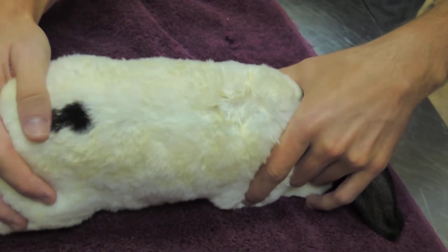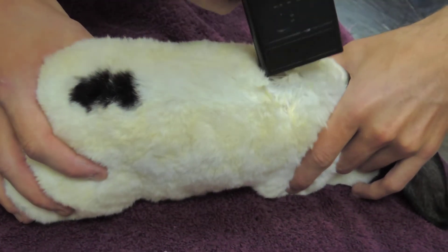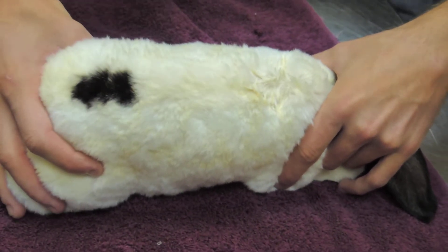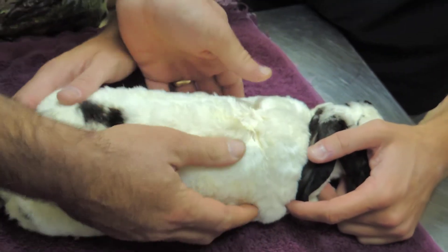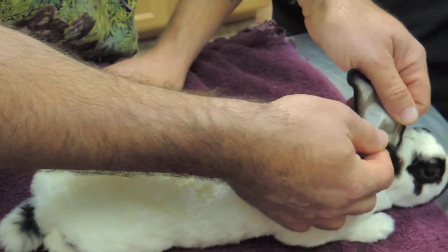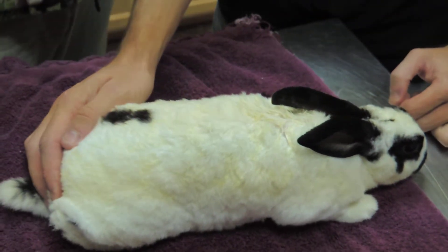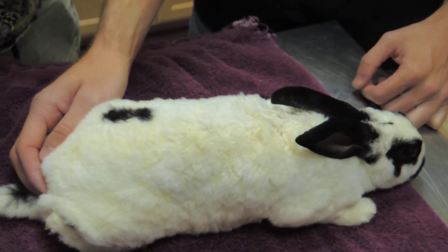Now we'll read the chip — about three, three and a half inches distance away. There's no hemorrhage or anything like that, so I think we're in good shape. That's a standard mammalian place to put those chips — in between the shoulder blades. That's a little dirty place.